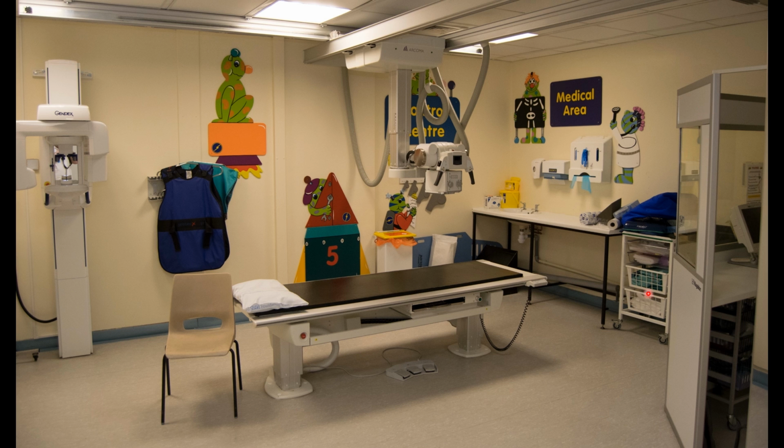For those of you who are radiographers or radiography students, never aim your tube this way. If you're doing a horizontal beam knee, don't bring your tube around here and aim it across this way. Don't ever aim towards that glass, ever. It's designed to stop scatter radiation rather than a primary beam. So please don't ever aim towards there if you can help it.